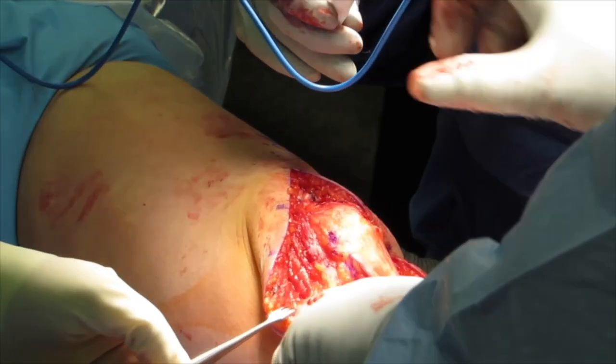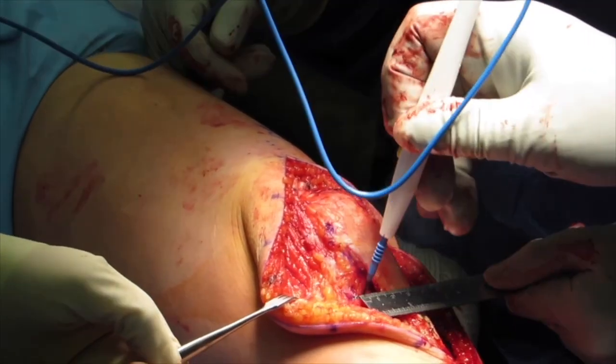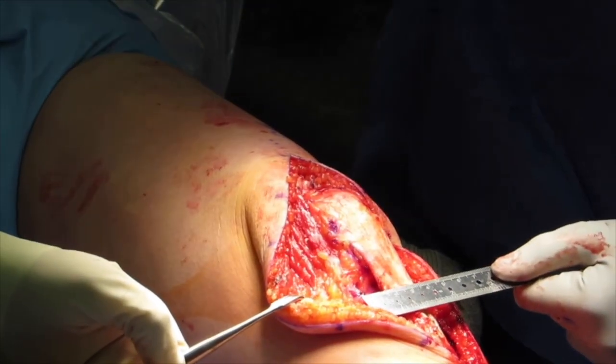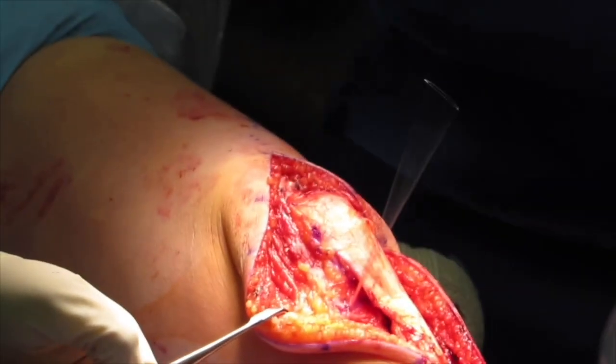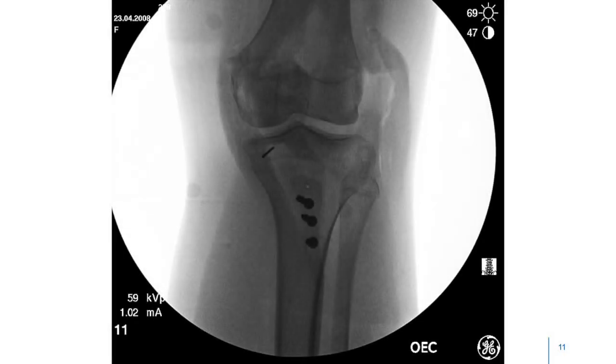After initial dissection, the planned site of the tibial limb for the MPTL reconstruction is identified in the proximal tibial epiphysis. This is located approximately 1 centimeter distal to the joint line and in line with the medial edge of the medial tibial spine, approximately 1 to 2 centimeters medial to the tibial tubercle. This is then marked with either a 1.25 or 1.6 millimeter K-wire and confirmed fluoroscopically.